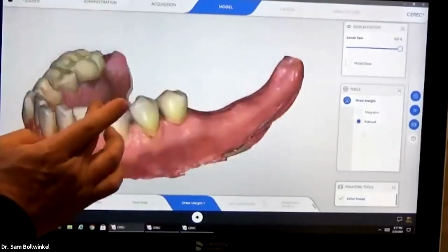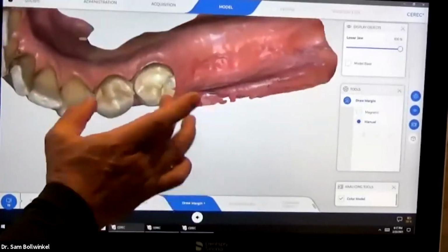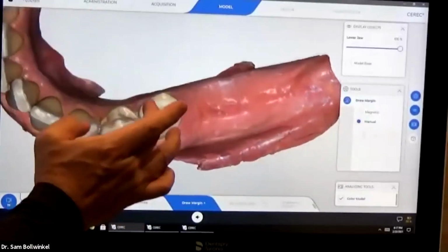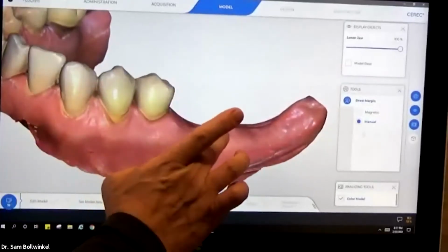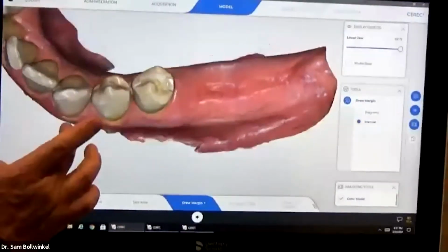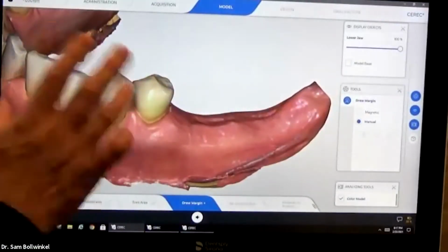These teeth were removed back in September, bone grafting done, the sites have matured, and now we're ready to place an implant for her. But what we want to talk about really is with restorative-driven implantology, you can see how flat our ridge is, how wide it is. This looks fantastic. Question would be, why don't you just flap it, open it up, drop the implant? We do it all day long. We've done it for years.